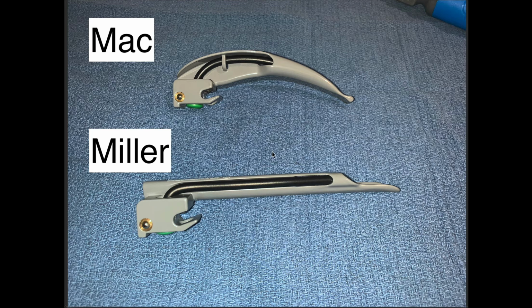Different people have preferences over these. Traditionally, the Mac blade is intended to be inserted such that the tip is just in the vallecula, just above the epiglottis, whereas with the Miller blade, the tip is intended to lift up on the epiglottis to theoretically give you a better view of those cords.